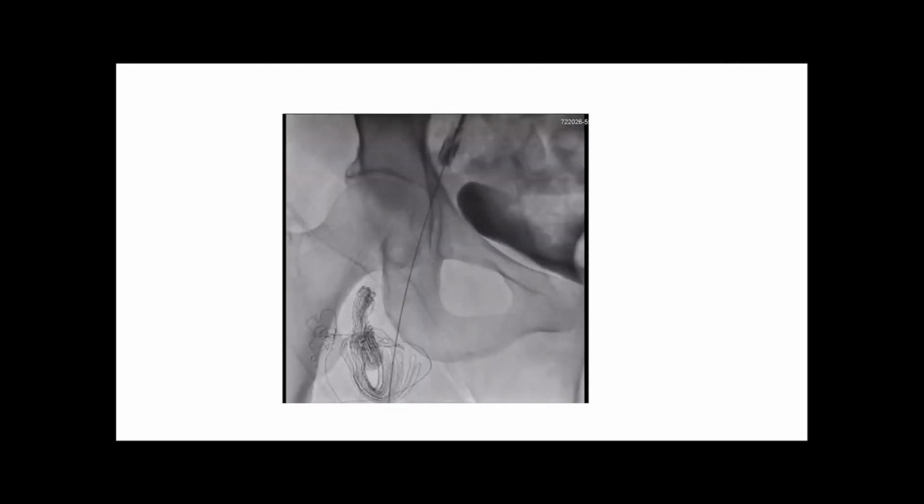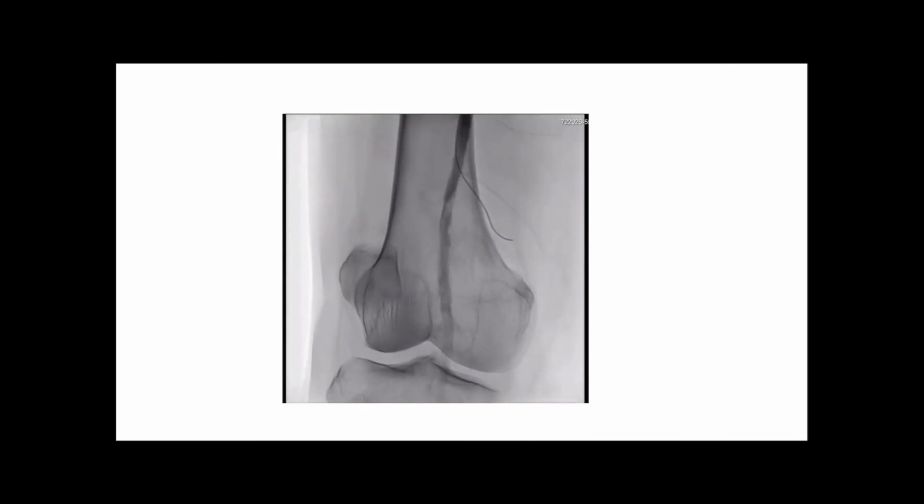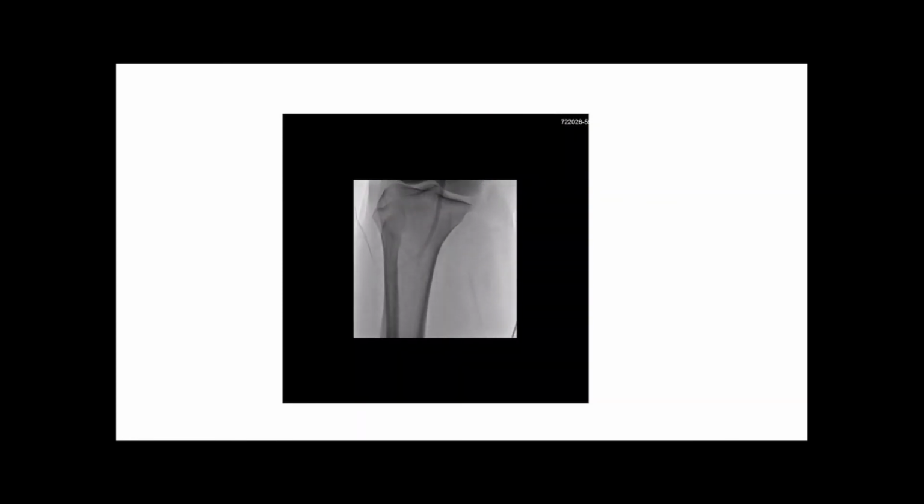So if you have a vessel closure, it's important that you diagnose in time, and here comes the role of checking the distal pulses before and after the procedures. If there was a pulse before and after the procedure you find that there is no pulse, that becomes important. It is also important in patients who have an intra-aortic balloon pump left for some time, as there are high chances of limb ischemia if you are not vigilant about the distal pulses.